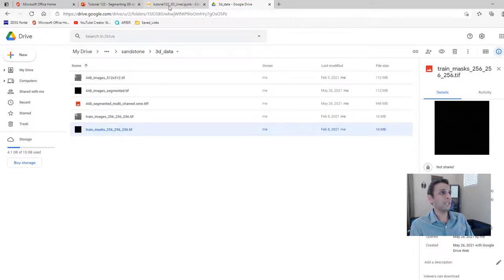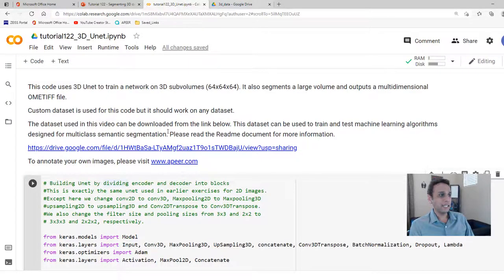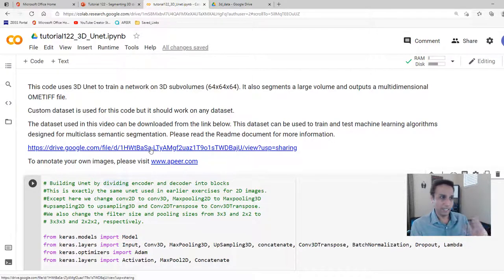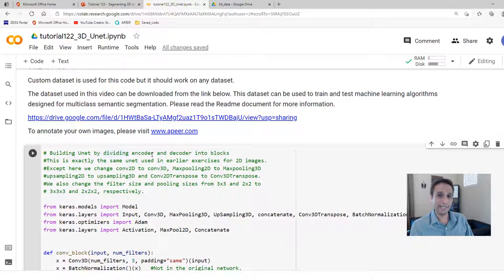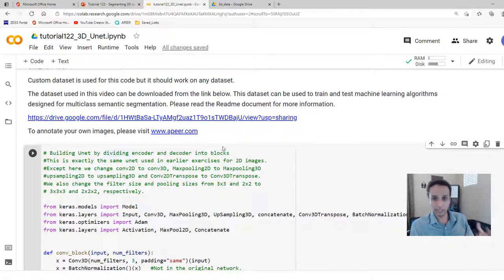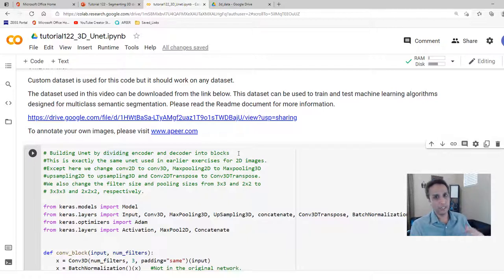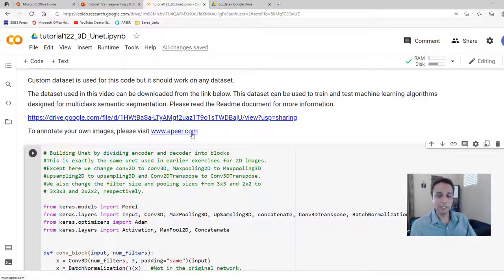The data is available via a link you can follow to download everything and work through this example. If you have your own images to annotate, you can visit apeer.com — it's free. Upload your images, paint your annotations (it requires patience), and when done you can also use U-Nets and other models available on the platform if you don't want to write your own code.